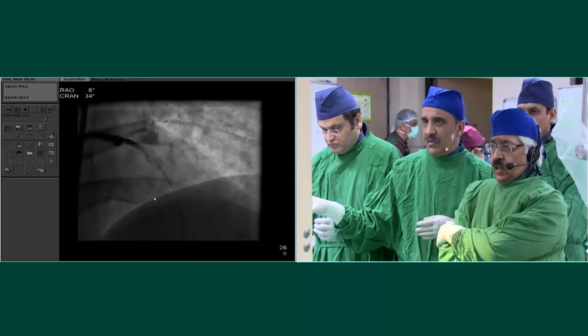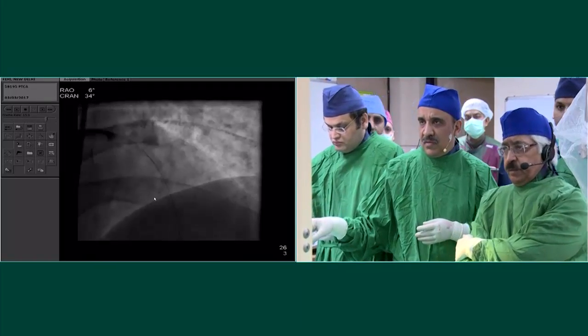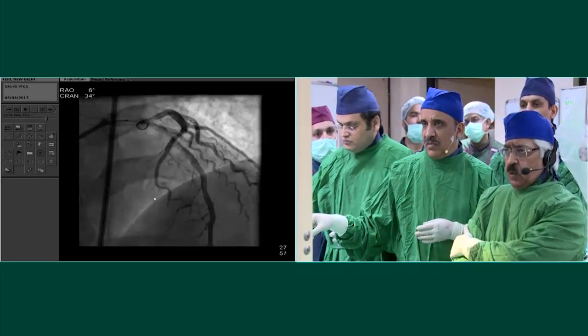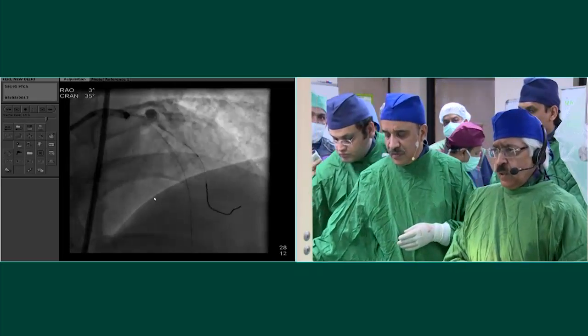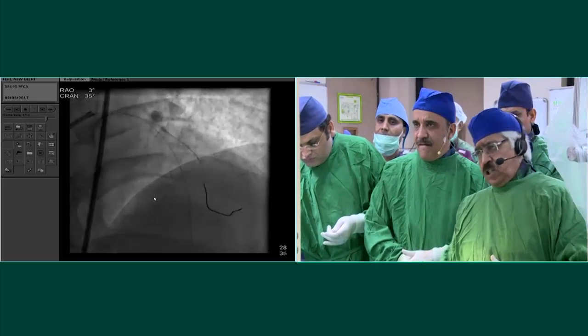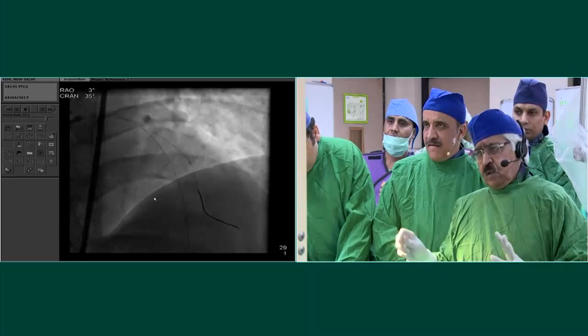So we had a struggle down to the diagonal. It was a big dissection. Next. This is where we noticed that the diagonal was gone. Remember, you were looking at the OCT. Next. And we finally crossed this diagonal. There was chest pain and there were ST-T changes. Next. And then this is where I left off.